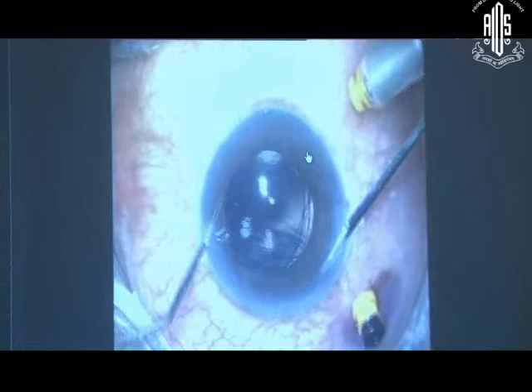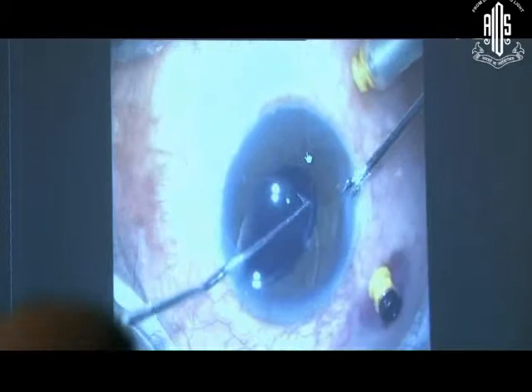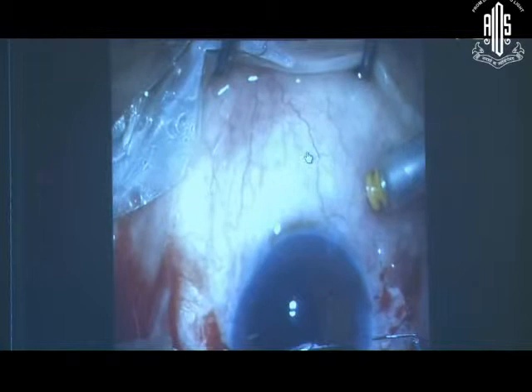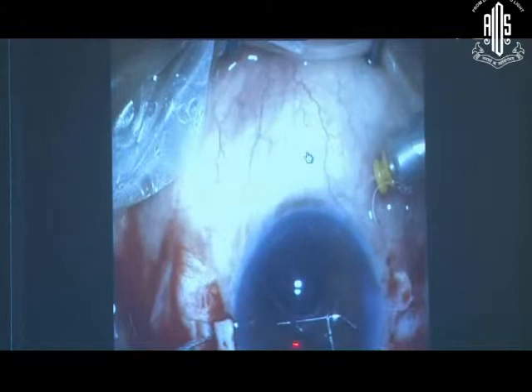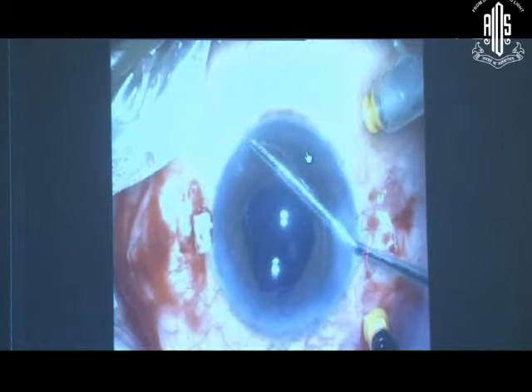PB sir used to teach us that a lasso suture is always an option when the lens is in the vitreous cavity. But what I did in this case — we planned for SFIOL. One thread is a double-arm with two arms and a straight needle. One needle has been bent, and through the eye of the haptic it has been passed through. Through the strap incision the other one was passed through without the eye, and that loop has gone inside. The similar process was repeated for the other side.